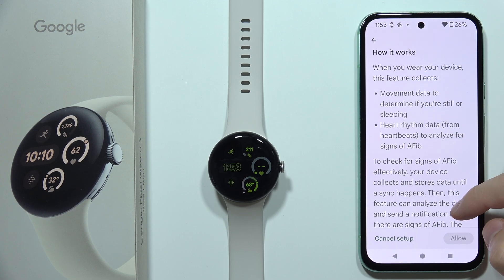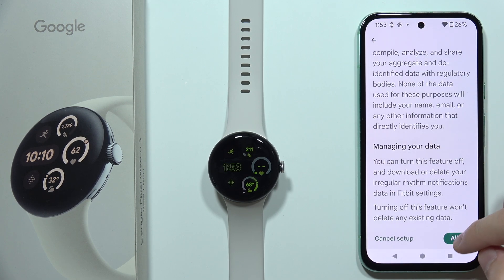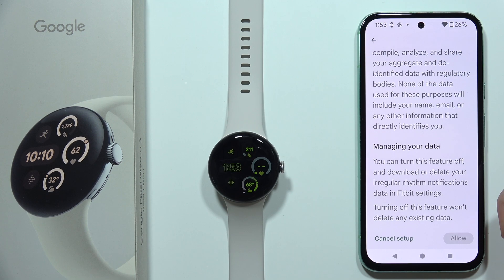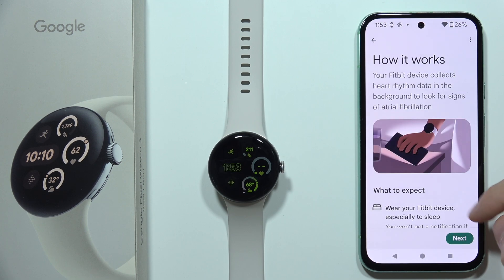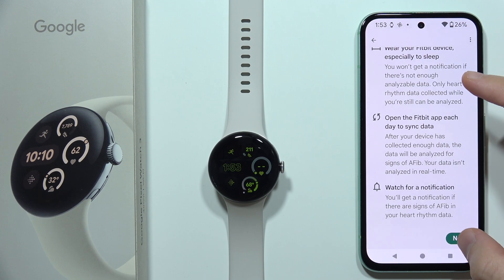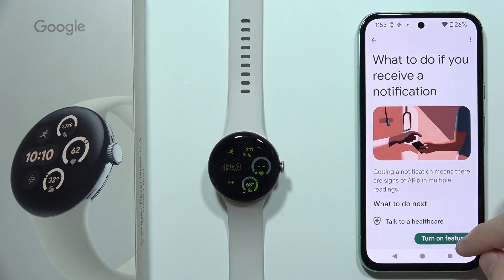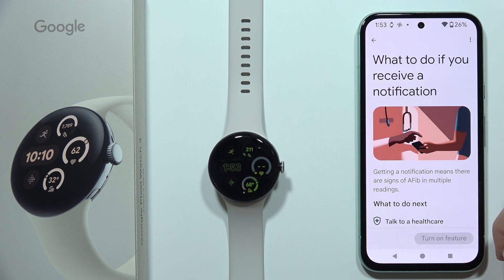Then you will have to read this — scroll all the way down and click Allow, then scroll all the way down again, click Allow once more, and click to turn on the feature.